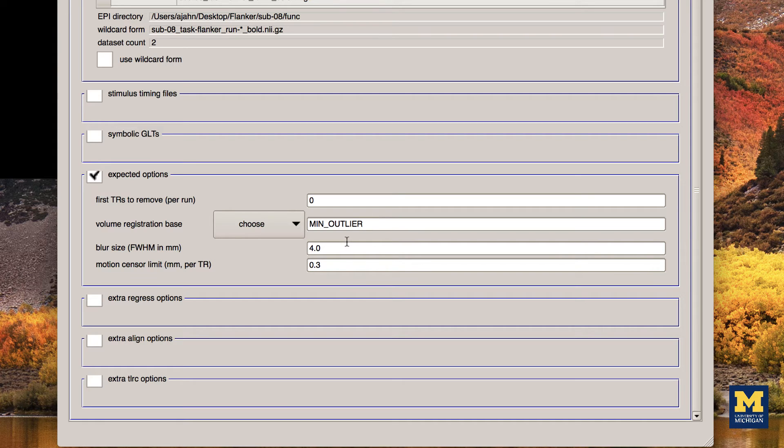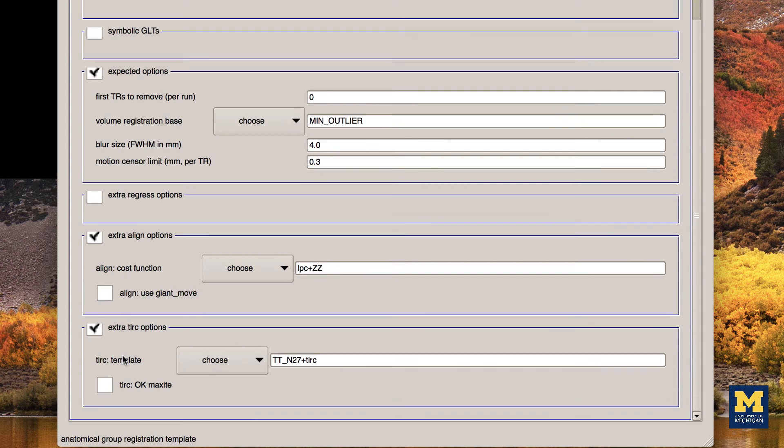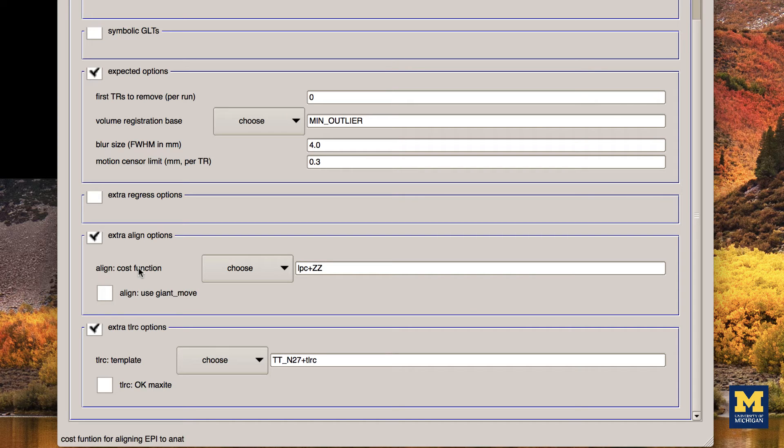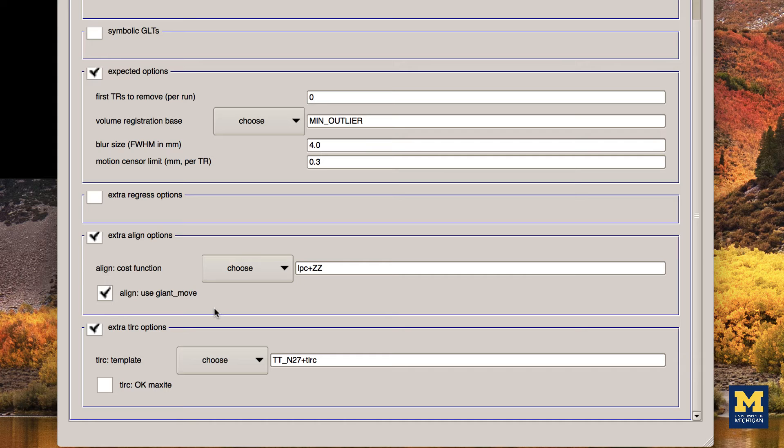Now, check the boxes next to Extra Align Options and Extra TLRC Options. The default cost function, or algorithm that will align the anatomical and functional images, is fine. However, I recommend checking the box next to Align, Use Giant Move. In case the functional and anatomical images are far away from each other, an option called Giant Move will bring them into a closer initial alignment.